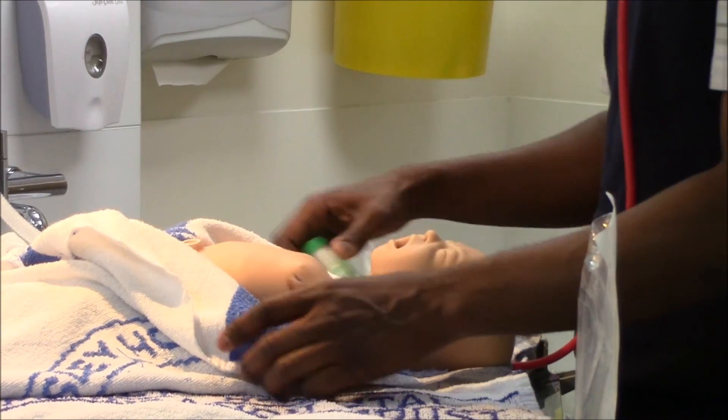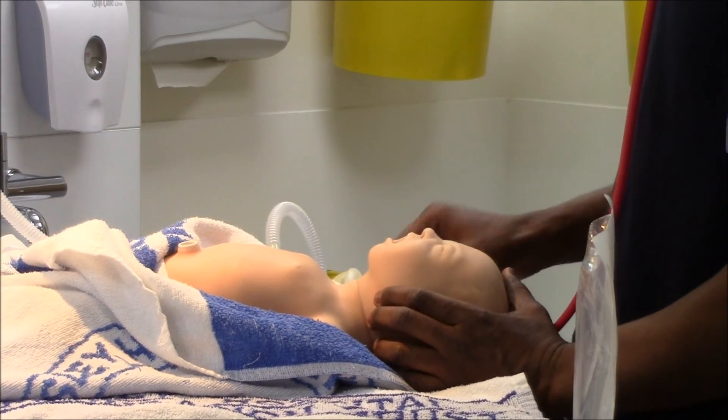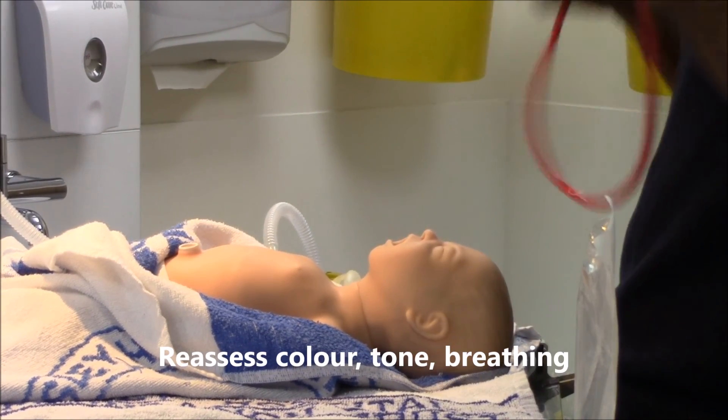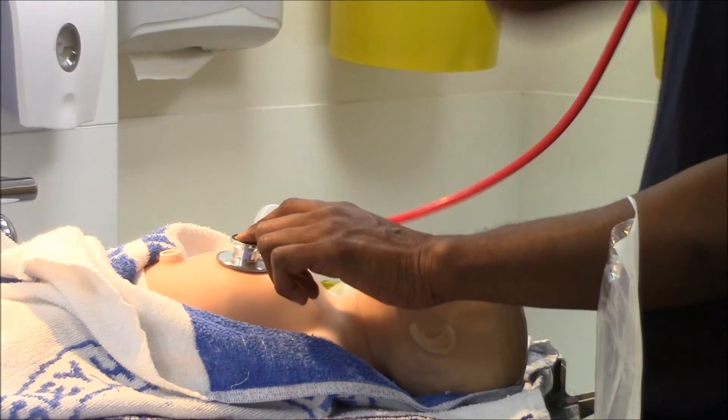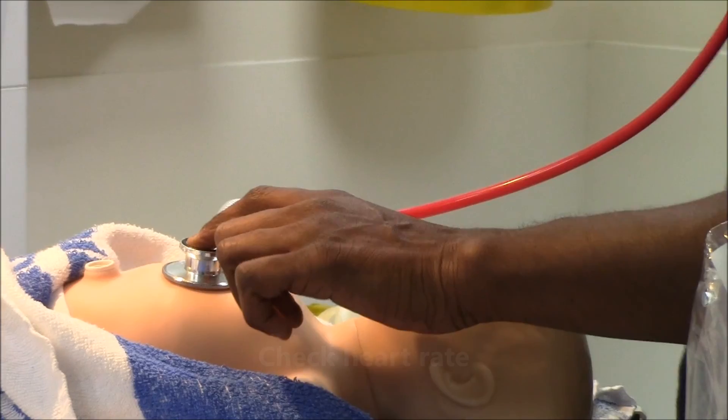I have seen very good chest movement towards the end there, but the baby is still looking pale, it is still floppy, it is not breathing, heart rate is still slow.